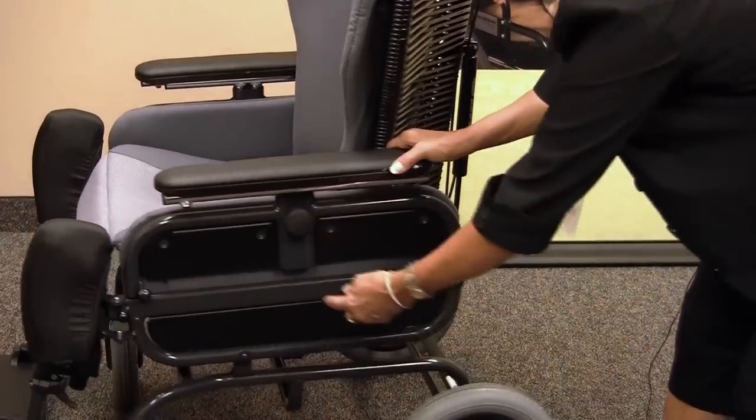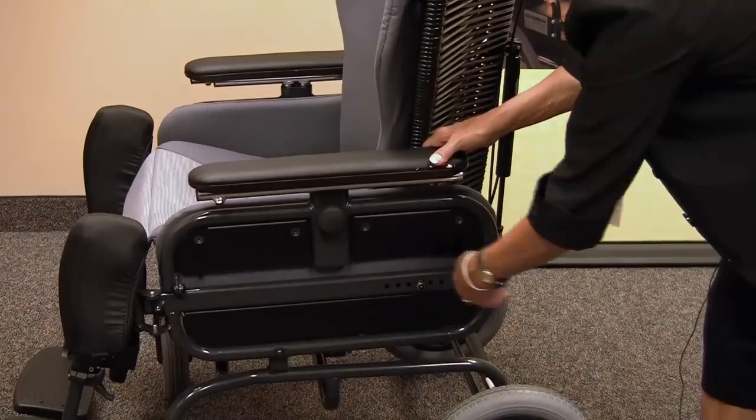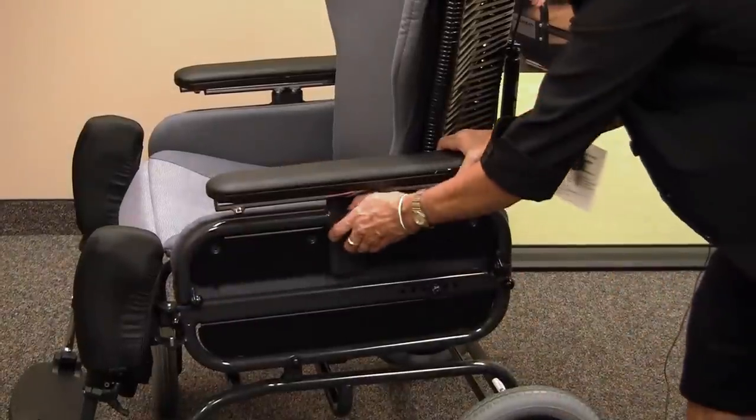On the Judy chair, it also offers an adjustable seat depth by adjusting here. We have a drop-down sidearm that is also adjustable in height.